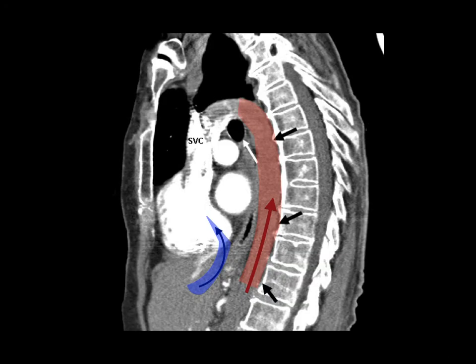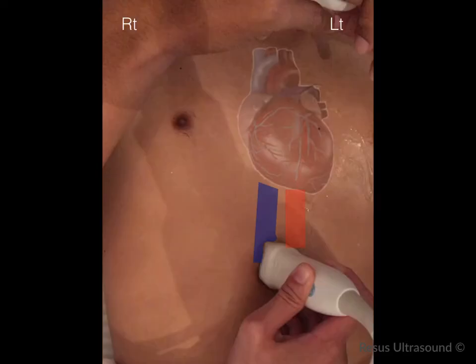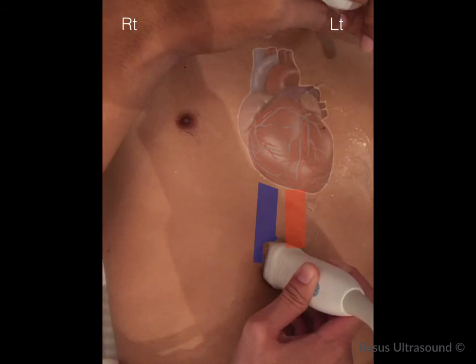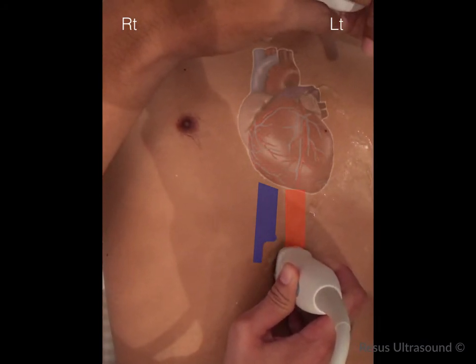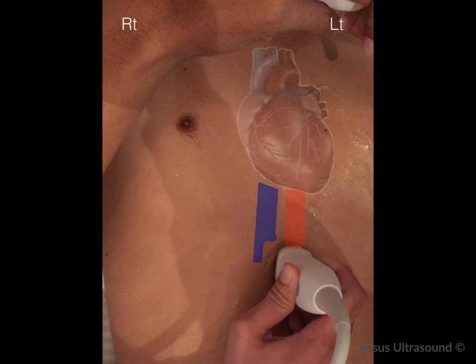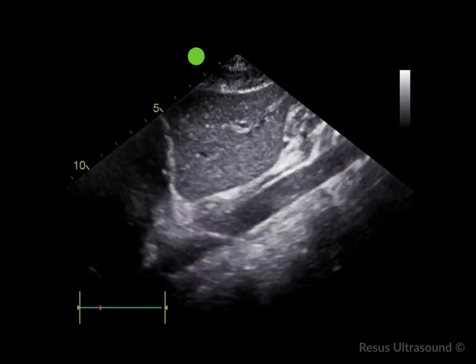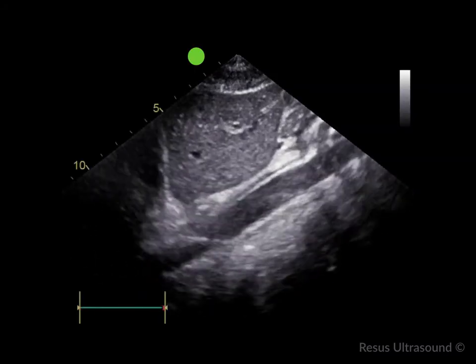Pitfall one: don't confuse the IVC with the aorta. In the sagittal plane, the IVC goes up to the RA while the aorta points down toward the patient's back. If you move the probe from right to left, you can see the aorta, which is pulsatile and has a thick white wall pointing downward toward the patient's back.